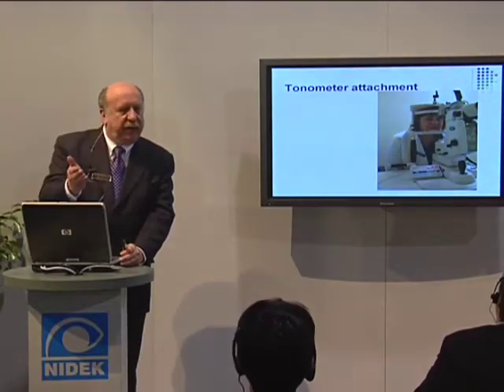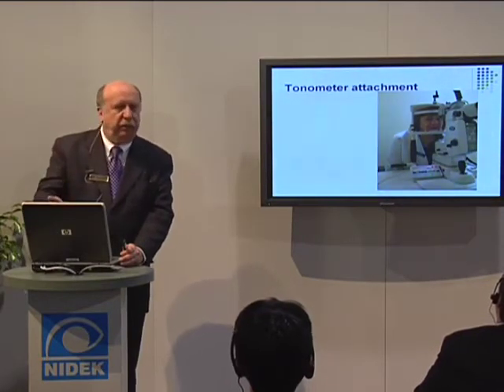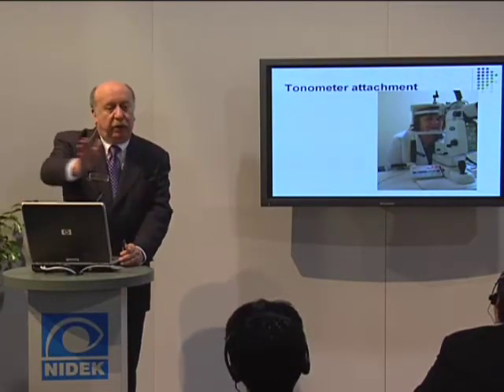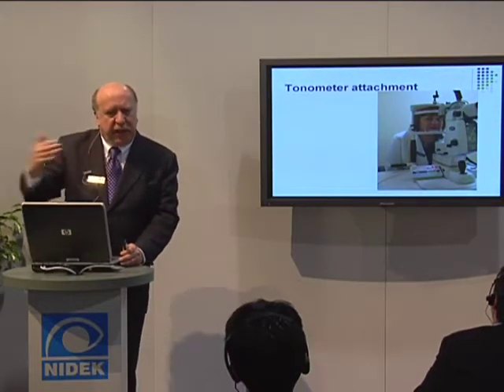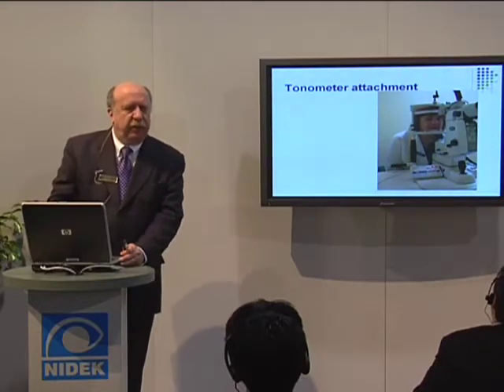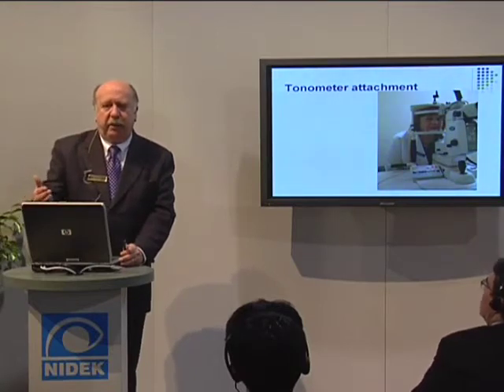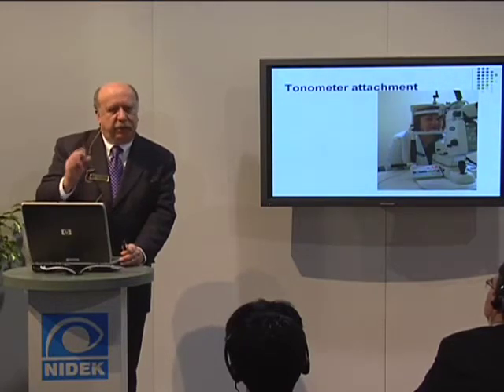To eliminate that, the classic split illumination system is employed with the Nidek, where you can swing the illumination to the side, where the actual illumination comes in, hits the mirror, and bounces out, and you don't see that reflection. With a Zeiss laser, you're having to tilt the lens or do other kinds of things to reduce the reflection. Now you say, okay, I can move my Zeiss laser to the side. The problem is, when you do that, either in the YAG mode or the 532 mode, you're introducing astigmatism.